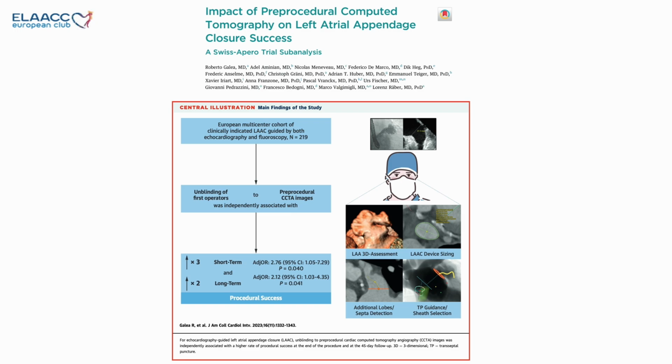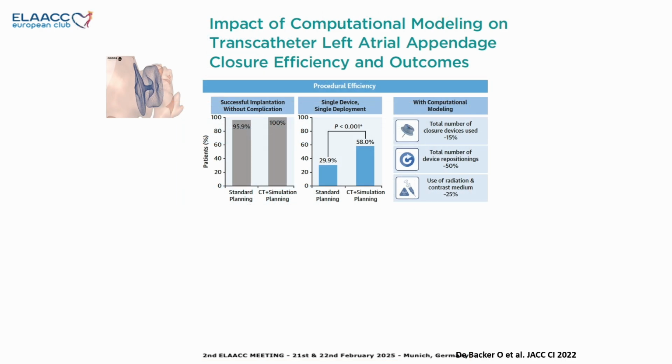Roberto and the Swiss Apero group have published this very elegant paper showing that upfront CT planification is associated with an increased short-term and long-term procedural success.